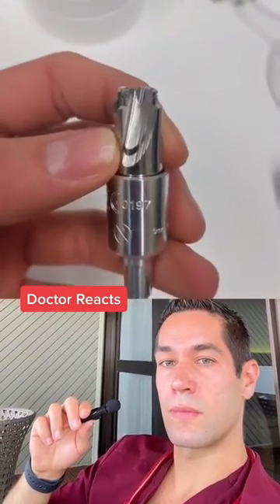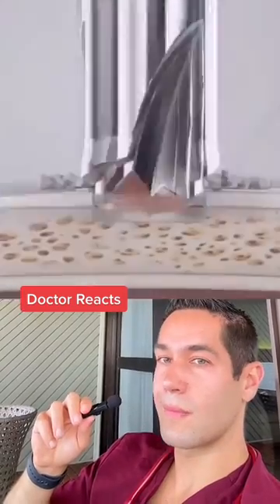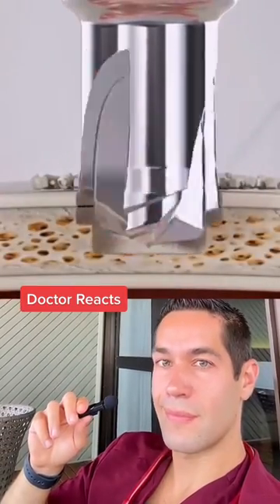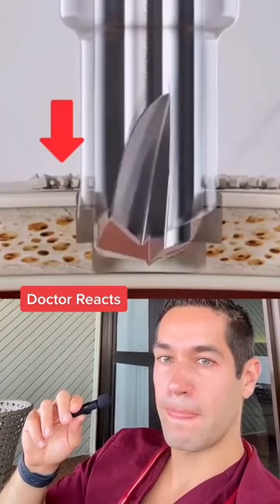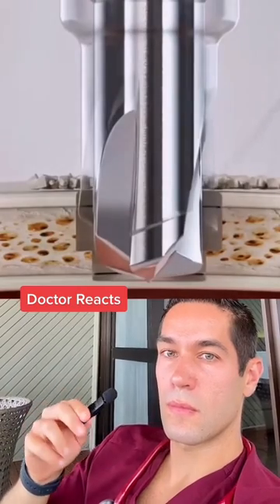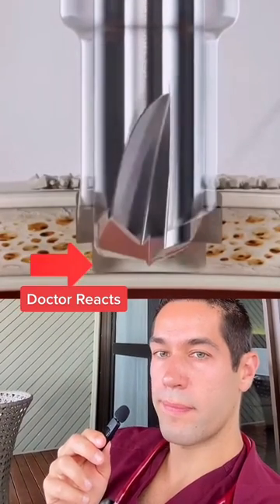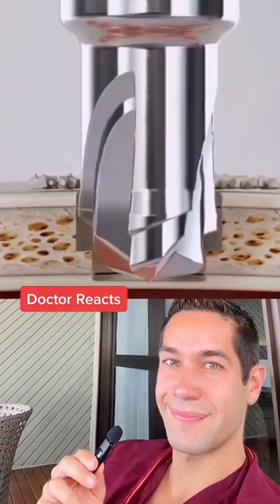Let's see how this issue is solved. Notice the cranial perforator has two moving pieces: an inner and an outer portion. The outer portion moves freely, while the inner portion is locked behind a spring-loaded mechanism. The drill bit only engages with downward pressure on the skull, and then is released when that pressure is no longer there. As soon as the inner portion depresses like that, it automatically stops.